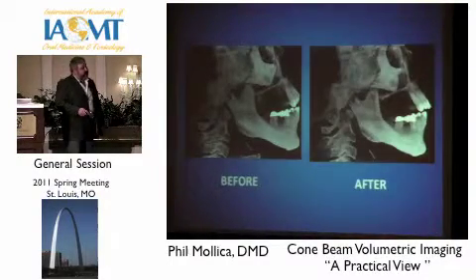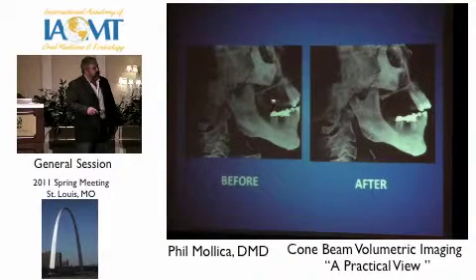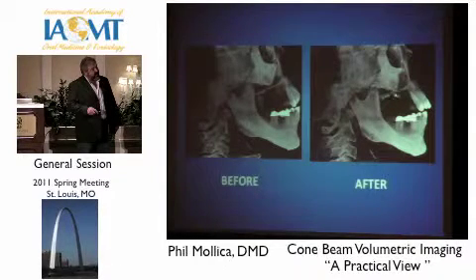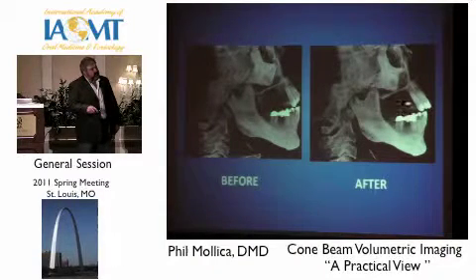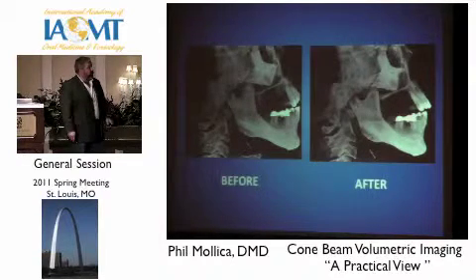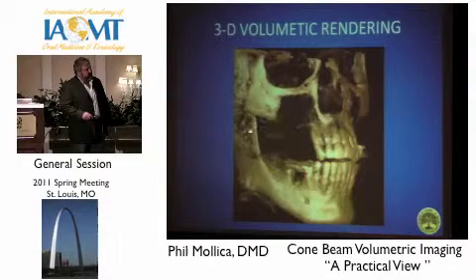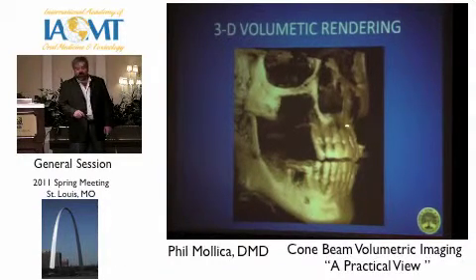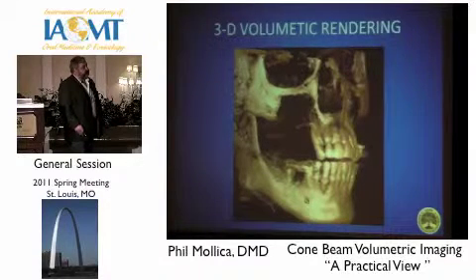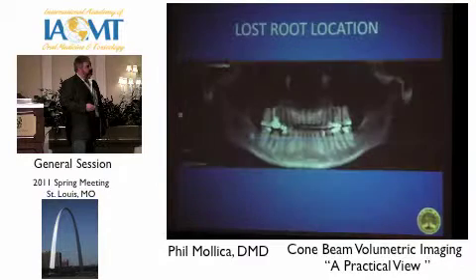So when you look at before and afters, you really can see now, this is where we were before on a scan, and then we go across here, you can see where the bone is all cleared. Now this here, this is up in his maxillary sinus area. This whole area of his maxilla is gone with the teeth. This is some of the things we're really going to be seeing more and more of. And we do it three-dimensional. Look at this. How much of his bone's gone associated with that bisphosphonate. Pretty dramatic. Pretty dramatic.